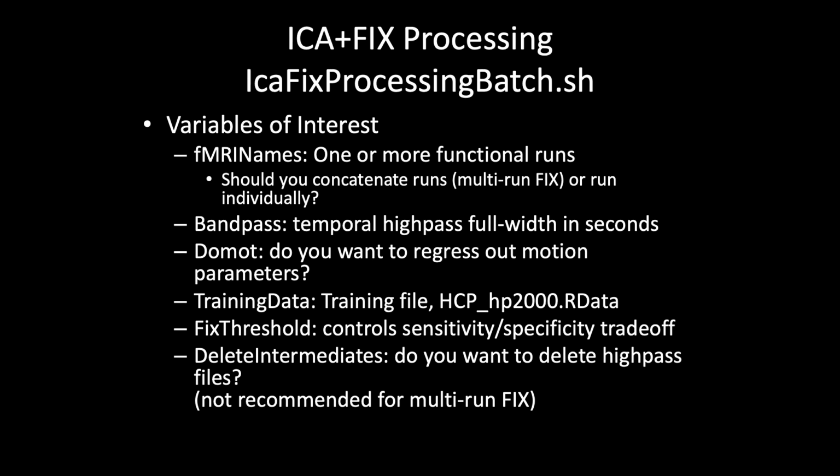Or does it make sense to concatenate or combine all this information across down the time series? Does that give us more accurate data? And the HCP FSL people right now are arguing it may be beneficial to combine all of these time series, even though some of them are task and some of them are rest, because it's having more data and having more time points, it does a better job of identifying what the noisy signals are. So that, again, is something that we're playing with right now to see how well it does.